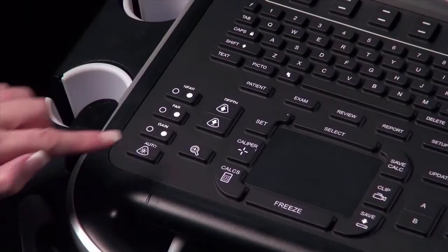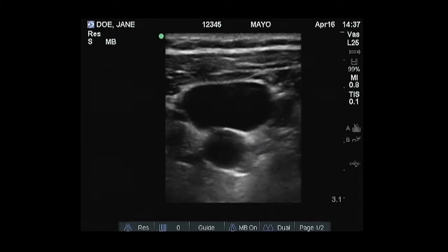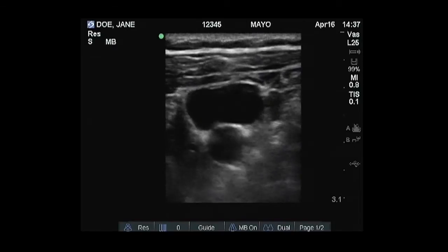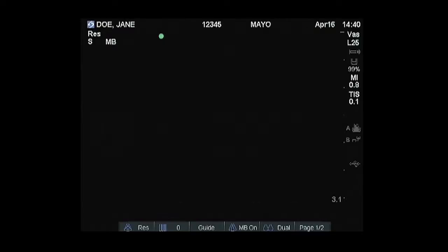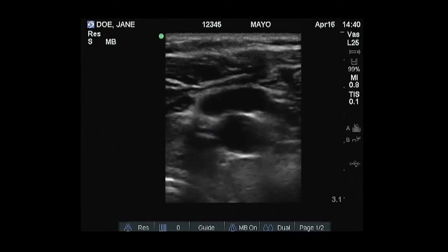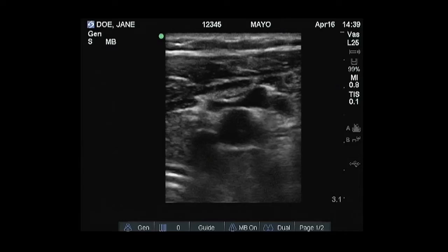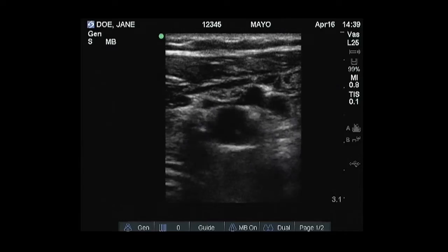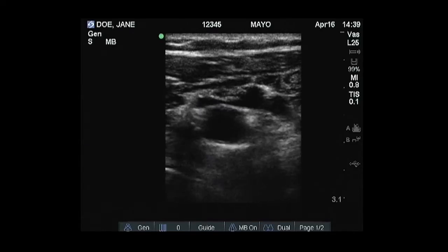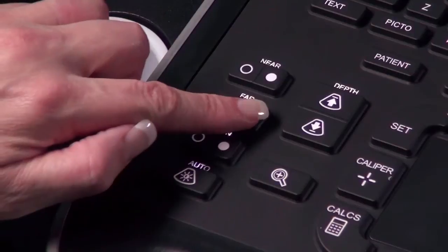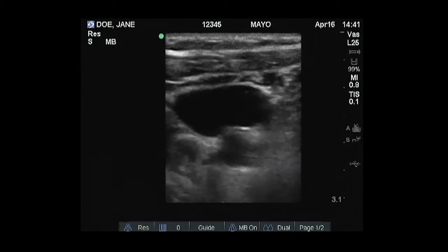The system has advanced image optimization technology that greatly simplifies user controls. Many of the controls, such as Tissue Harmonic Imaging, SonoMB, and SonoHD, are automatically activated with exam type.